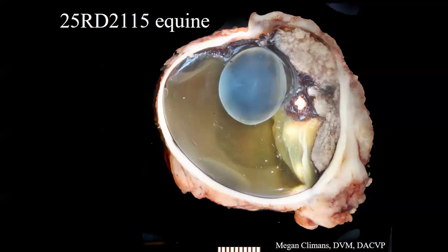The other eye, interestingly, the left eye, had a third eyelid mass consistent with squamous cell carcinoma, but the biopsy was currently pending when we got this eye. So, sort of bilateral squamous, potentially. Spoilers. It's a spoiler. I'm just going to keep going. You may already be on the same wavelength anyway.